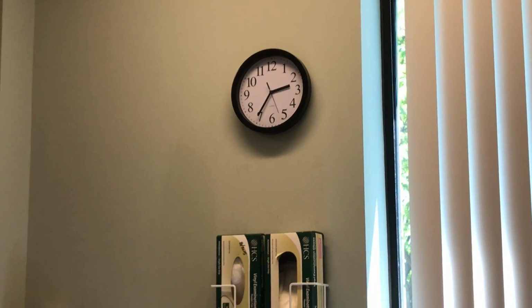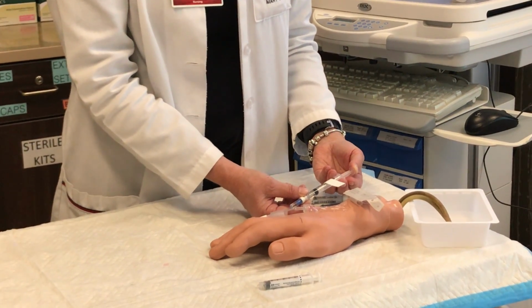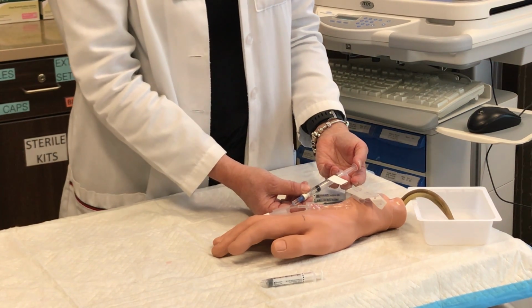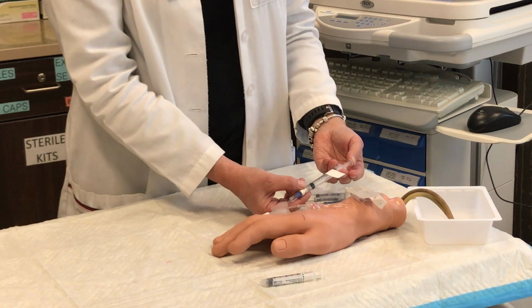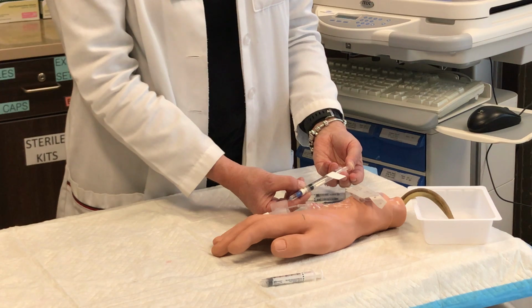After 30 seconds has passed, I'm going to again push 0.1, 0.2, 0.3, 0.4. Again, I would wait 30 seconds, but for time purposes, we'll just pretend that the 30 seconds has passed. After that 30 seconds, I push the next 0.4. 1, 2, 3, 4. Wait 30 more seconds. Once 30 seconds has passed, I push the final 0.4. The whole time I'm assessing my patient.